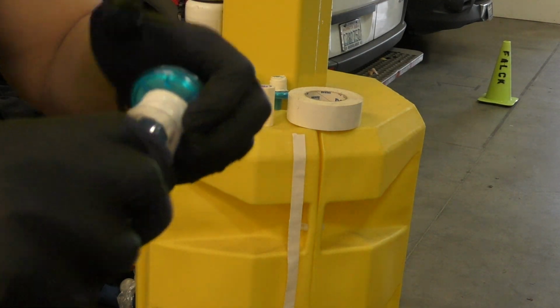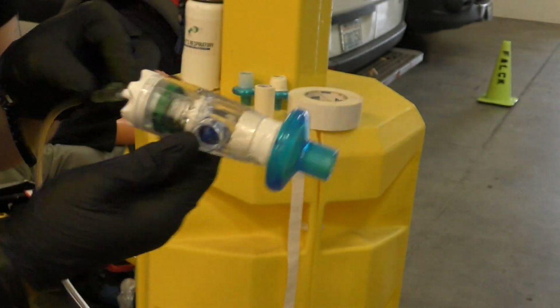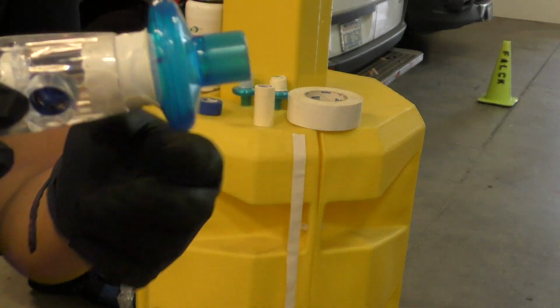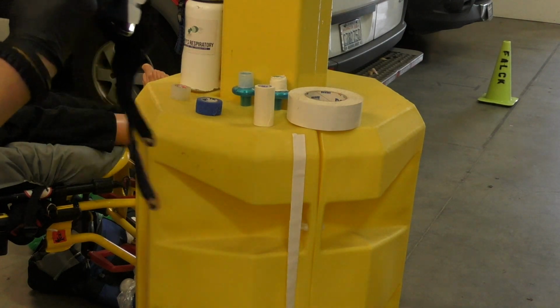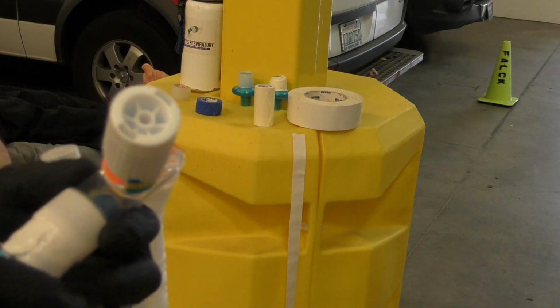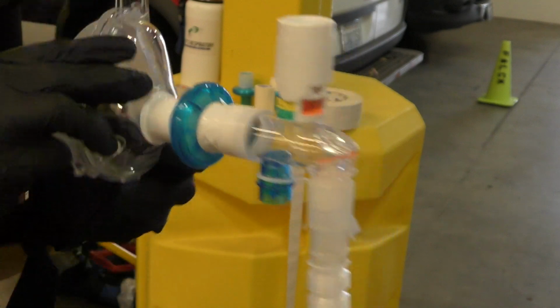But that's enough. See, one of those is good. I sliced two in half, and then if you screw up, you could use that one, but you just need that one strip and that should do it. Just like that. For the other mask as well. Fits like a glove. And there we go. So we have those protected for you.